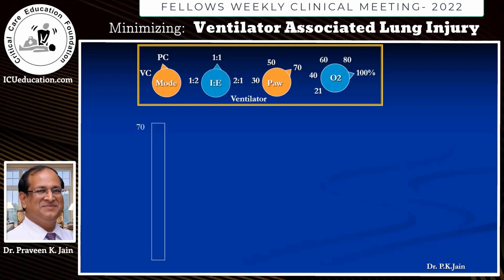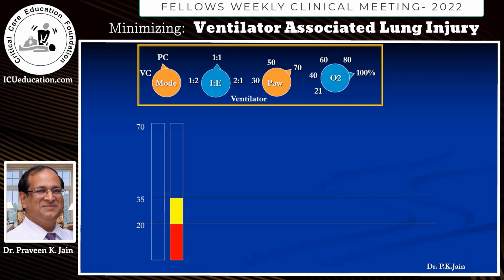And I switch the FiO2 to 100% only because it's easier to calculate the PF ratio. I then set the PEEP on 20, empirically, and the peak airway pressure at 35. I do this to check whether the patient is hemodynamically stable. If not, I would give 1 to 2 liters of fluid fast so that the hemodynamics stabilize. This is not recruitment. Even though the PEEP is 20, I call this pre-recruitment.